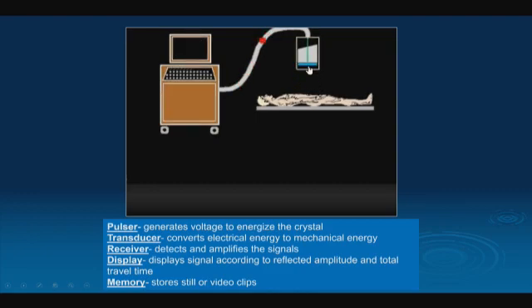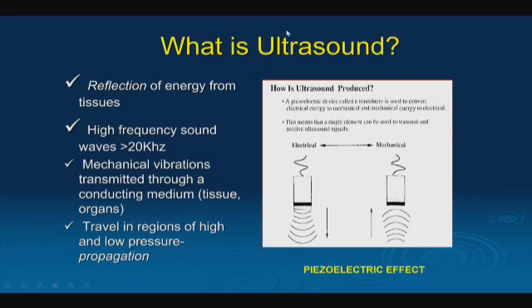We always get a little bit of refraction where the sound wave goes off in different directions, but our goal is to get the majority of that sound wave to return back to the transducer. When it does so, it's converted back into a radio frequency signal, goes through the system's processing, and is then displayed on the monitor for you to evaluate. That whole series of events is basically just converting electrical energy into mechanical energy, that is a sound wave, and then converting the sound wave back into electrical energy for you to evaluate.